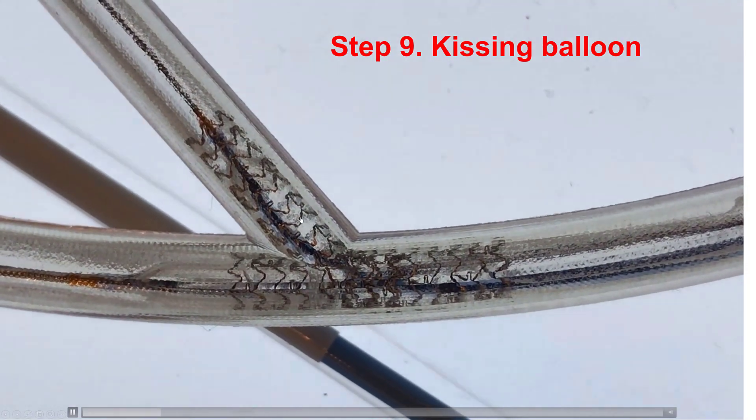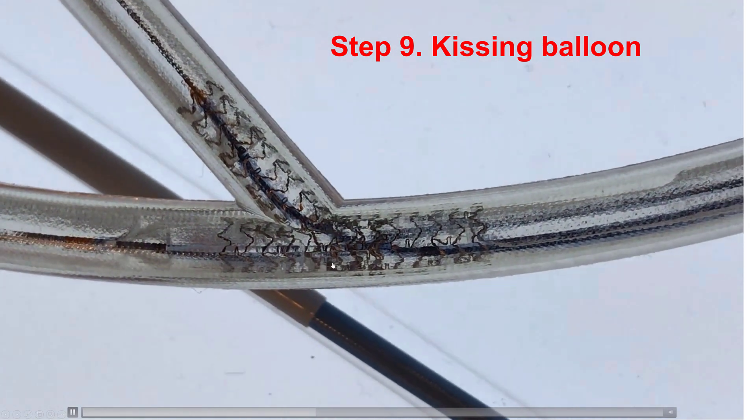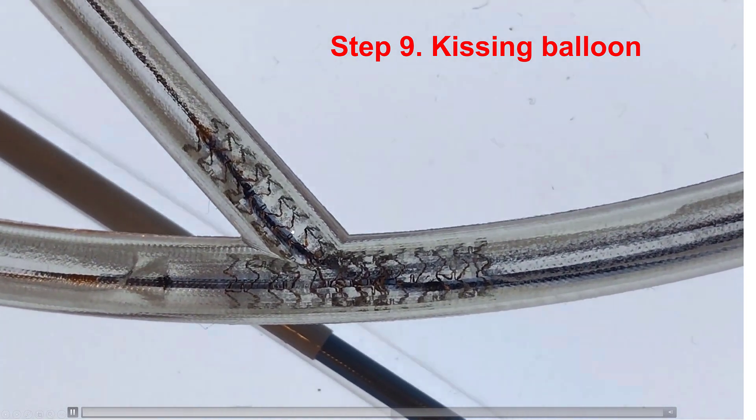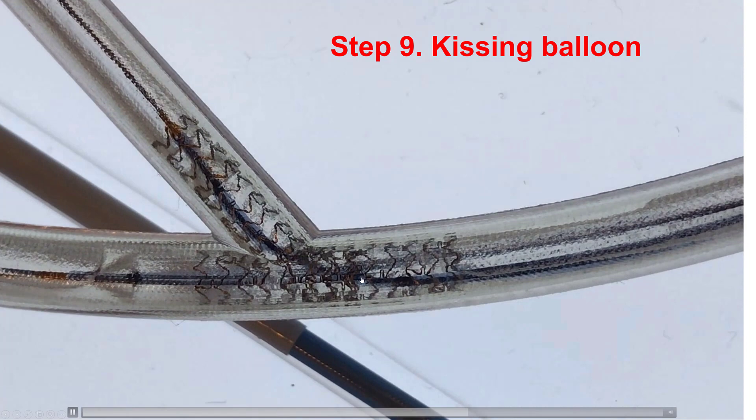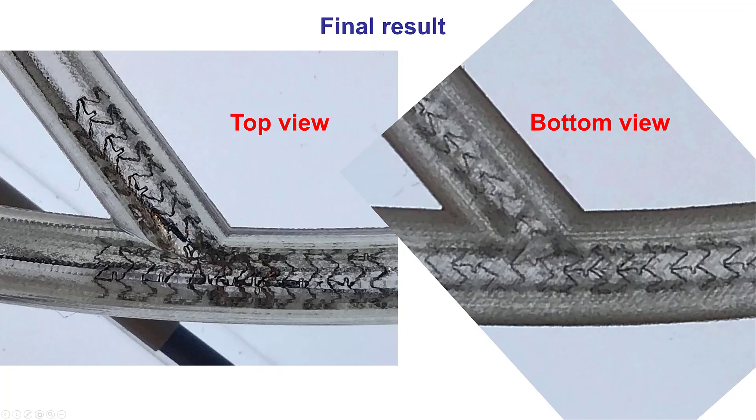Step number nine is to advance a balloon into both branches, and then inflate the balloons together in a kissing balloon inflation mode. Step number ten is to get a shorter balloon and perform the proximal optimization technique in the proximal portion of the stent. And this is the final result — this is the area of the side branch stent that has been protruding and has been crushed against the wall of the main vessel and against the originally placed main vessel stent.